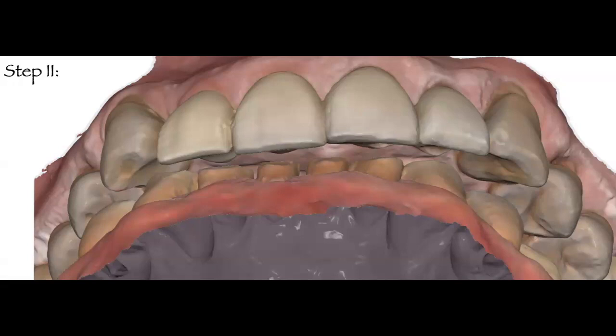Again, I will have the patient move their jaw forward all the way up to edge, and then come right back to try to accomplish maximum intercuspation. Again, because the leaf gauge is in front of the maxillary incisors, there will be no posterior teeth in contact, and then I will wait a minute or a minute and a half again. When do I stop adding these leaf gauges? I stop adding the leaf gauges once a minute or a minute and a half go by and the patient doesn't feel any posterior tooth in contact.